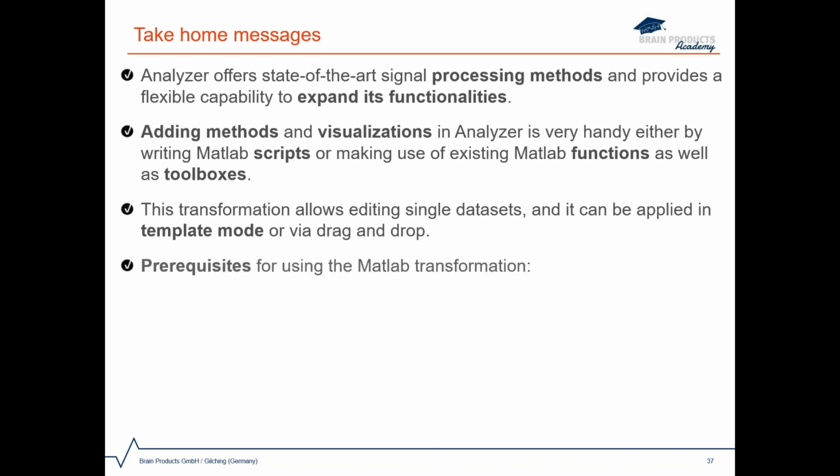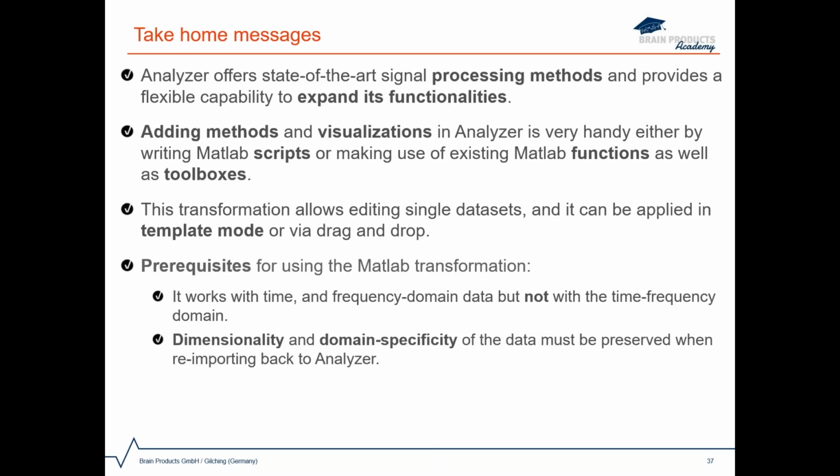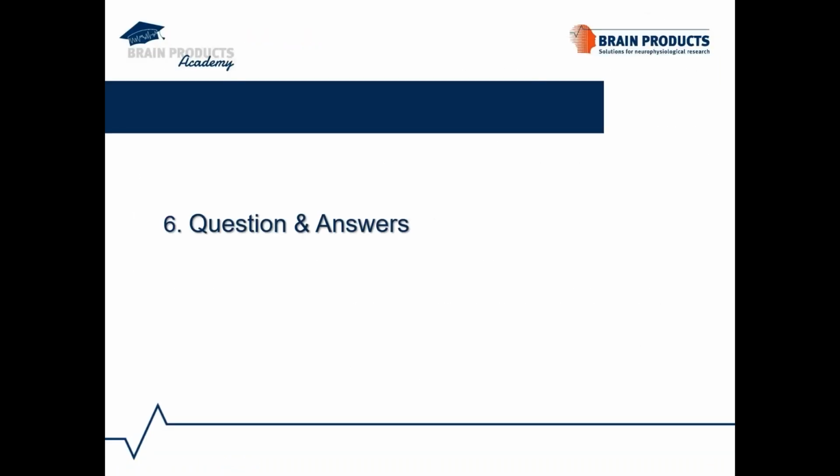There are prerequisites for using the Matlab transformation. Please note that it works with time and frequency domain data, but not with time frequency domain data. The data dimension and type should remain the same when re-importing back to Analyzer. Importantly, it requires a valid Matlab installation and license. And with this, I finish my presentation, and we now have some time for open questions.